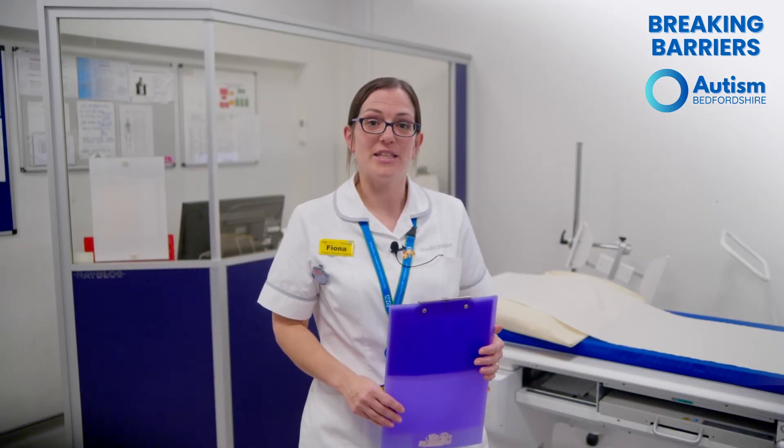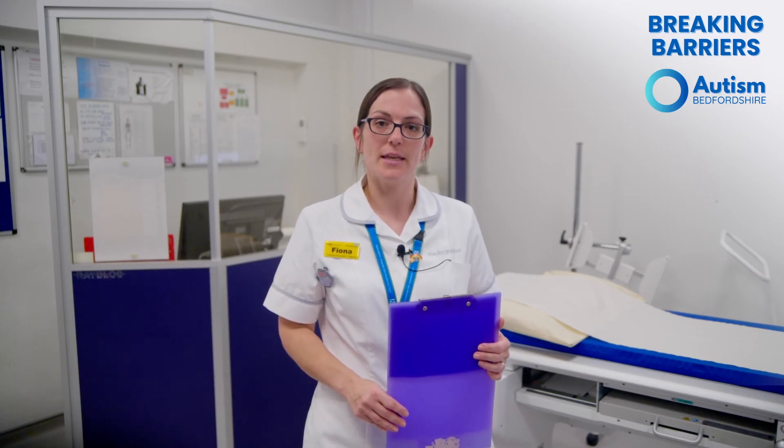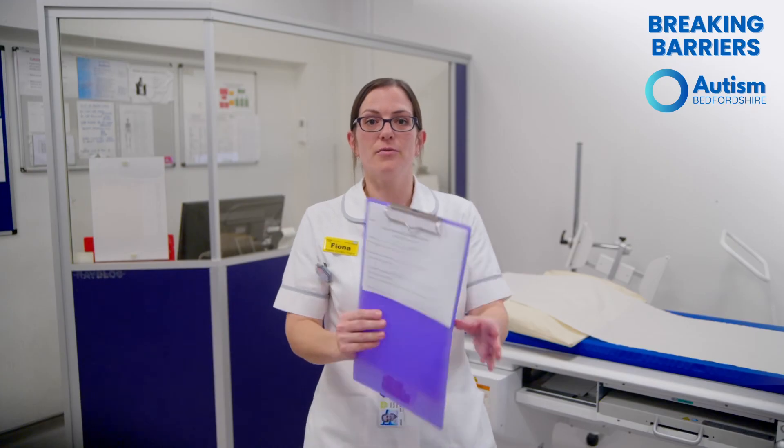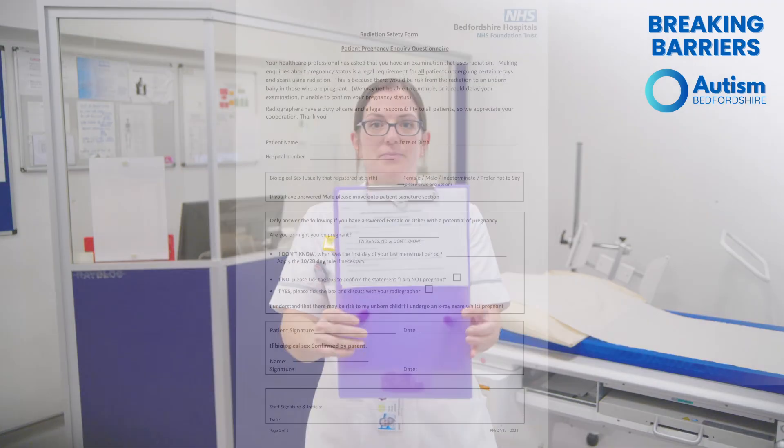For certain examinations and depending on your age, the radiographer may need to ask if you might be pregnant before they can take the x-ray. They will ask you to sign a form like this to confirm it.